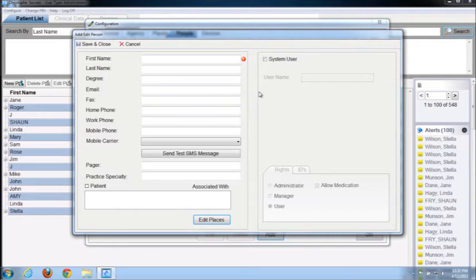There are 3 levels of access: user, manager, and administrator level. A simple user has limited access rights and can mostly only view the data of their assigned patients, but cannot make any changes. An administrator has the ability to make any changes that he or she wishes to make. A manager is typically a case manager who is not allowed to add or remove patients or access patient data, but can make some changes such as set up or modify monitor settings for alerts or send questions or instructions to the patient via the monitor.